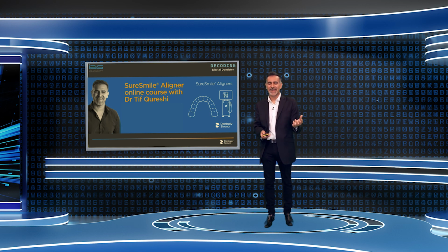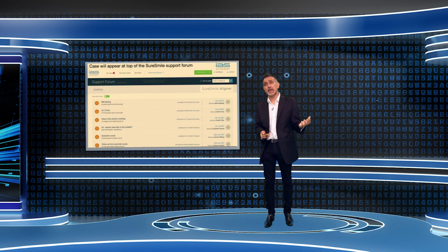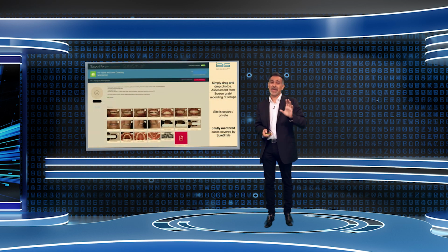They're done online currently and live potentially very soon. We take the course program together, and once that is done and we go through all the basics, cases are actually submitted through a form. Basically, we will check the cases before they even begin by simple drag and drop. This is all done through an IAS platform.